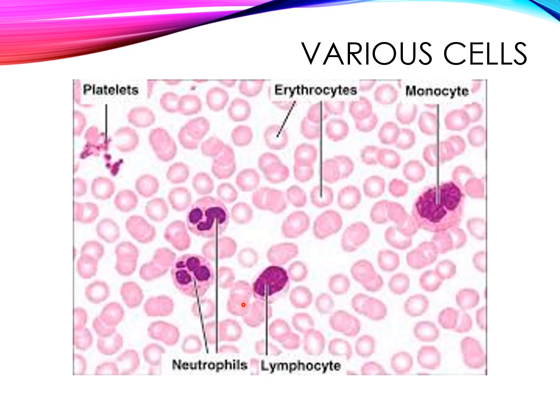Now, white blood cells are these guys here. They are much bigger than the red blood cells. They have a nucleus that usually takes up the blue stain. And here we have two neutrophils, which usually have multi-segmented nuclei, a lymphocyte, where the nucleus usually takes up the entire cell, and then a monocyte, which is usually the biggest of the white blood cells and also has more of a kidney-shaped nucleus.